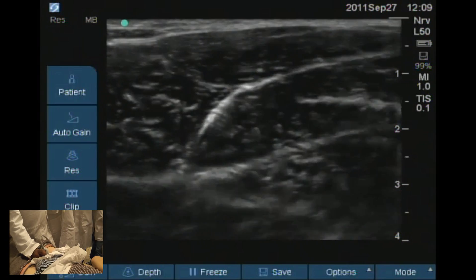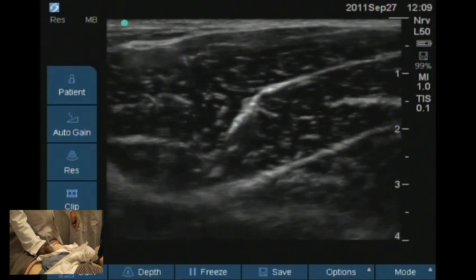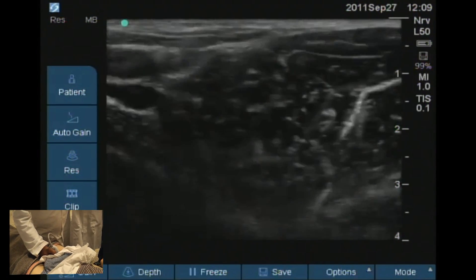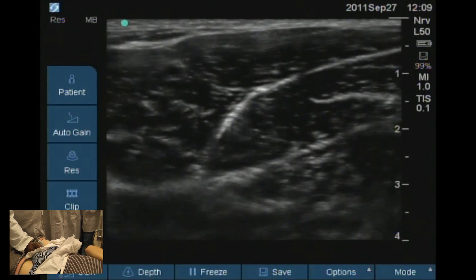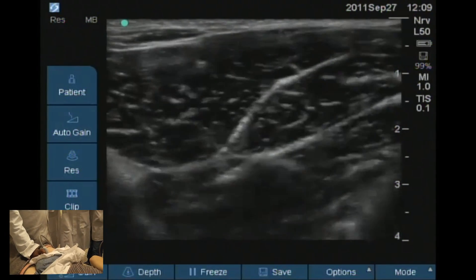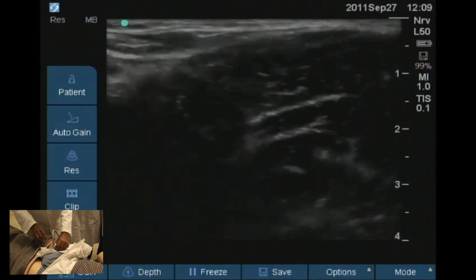This is quite a deep nerve and it's very difficult to do in-plane. If you do in-plane from here, everything might look okay, but you could be going through the femoral artery. Because the artery is not in the picture, you might think you're okay, but you could be inserting the needle and going through the femoral artery. So the best technique for this obturator block is out-of-plane.